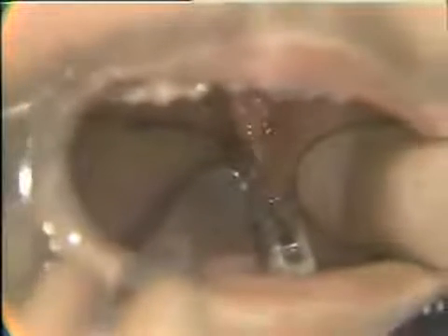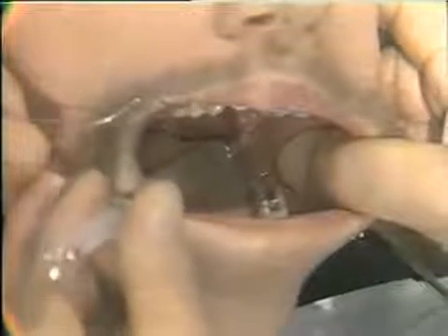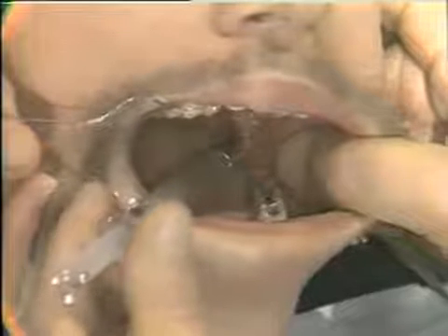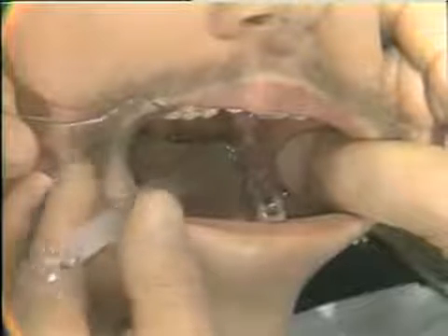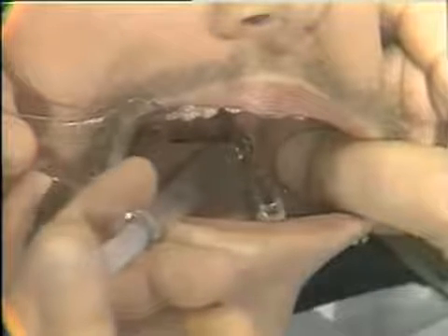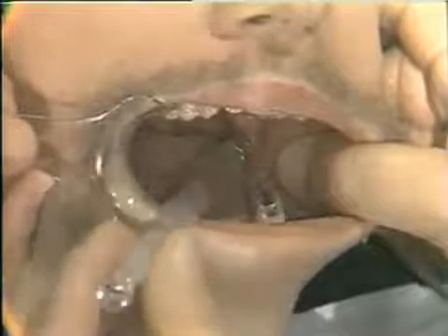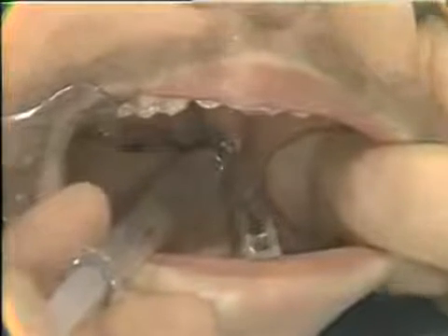The puncture is made, and I have penetrated approximately a centimeter and a half. Now I know I am by the obstruction of the internal oblique line. Now I'm going to increase the angulation of the syringe slightly so that now the barrel is approximately over the molar on the other side. I'm going to sneak on in and very gently try to get needle contact with bone at 2/3 of this distance across the ascending ramus. This I have done, and now I'm going to aspirate carefully, and we see that we're in a safe position. And now I'd like to show, if we can, my rate of injection of the anesthetic solution.